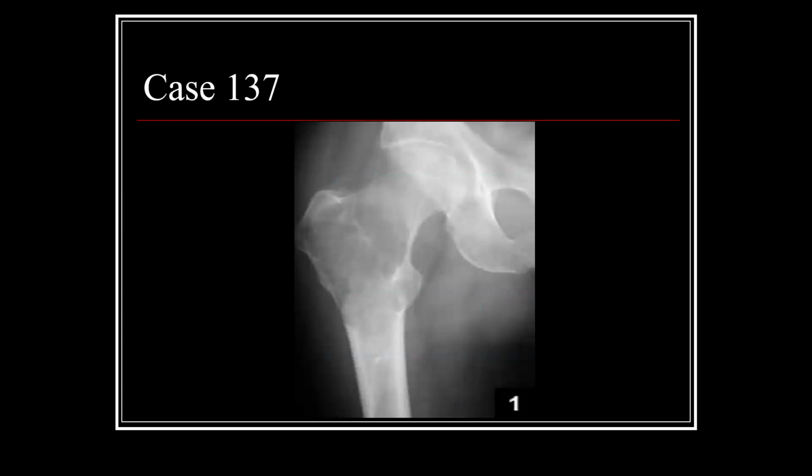Well, how about this lesion? How would we describe this lesion? Well, it's obviously got a fairly sharp margin, at least in some areas. It's somewhat expansile, it's lytic, but it's not behaving with an aggressive type of margin. And so this type of lesion might fit into something like fibrous dysplasia or something that has a slower growth phase and allows the bone to be remodeled and readjust to the expanding lesion inside.